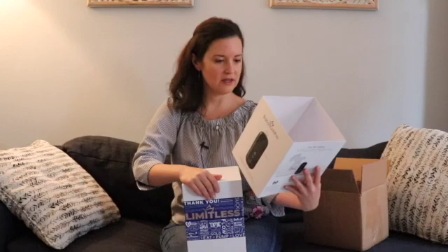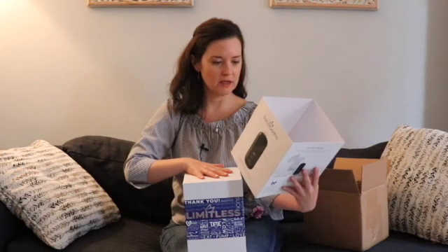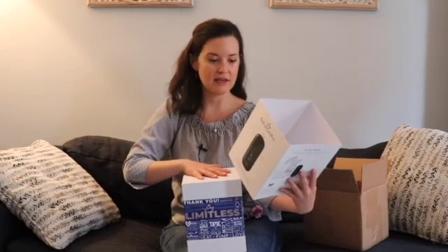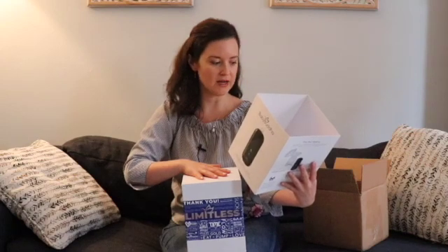It's interesting that it only comes with the 24 millimeter, so make sure that if you do decide to try this pump that you do get fitted for a proper flange size, and if you need a smaller or a bigger flange, make sure to order that ahead of time.